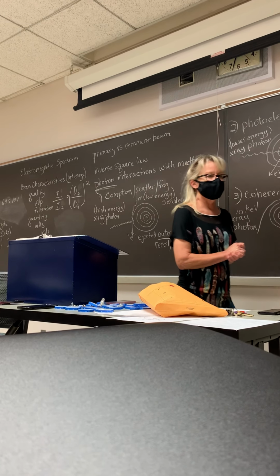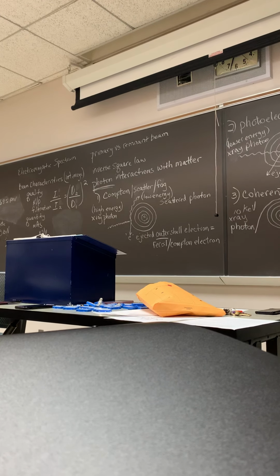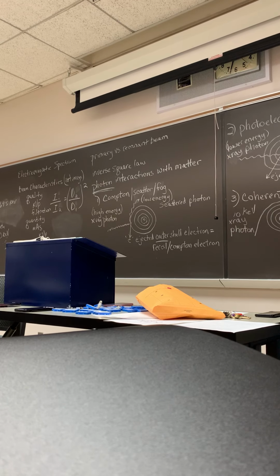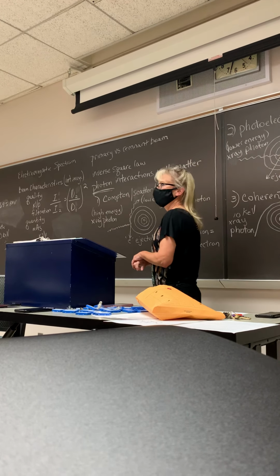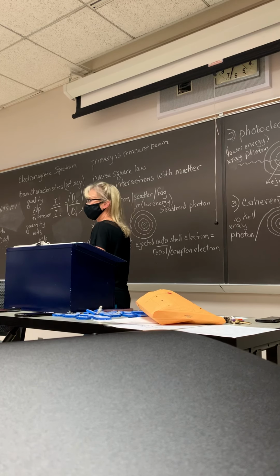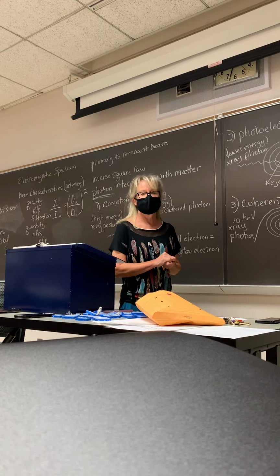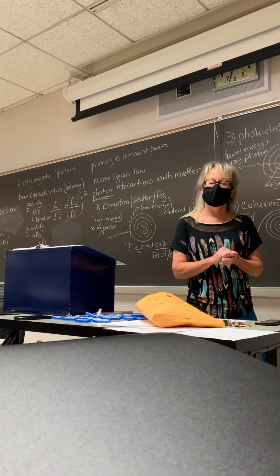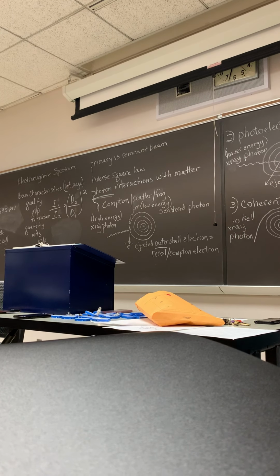Okay, primary and secondary barriers. What's a primary barrier? What has to be a primary barrier in an X-ray room? When you build an X-ray room, what has to be primary? The wall. Good, the wall. Up to how high? Good. The wall up to 7 feet. Usually no one's taller than 7 feet.